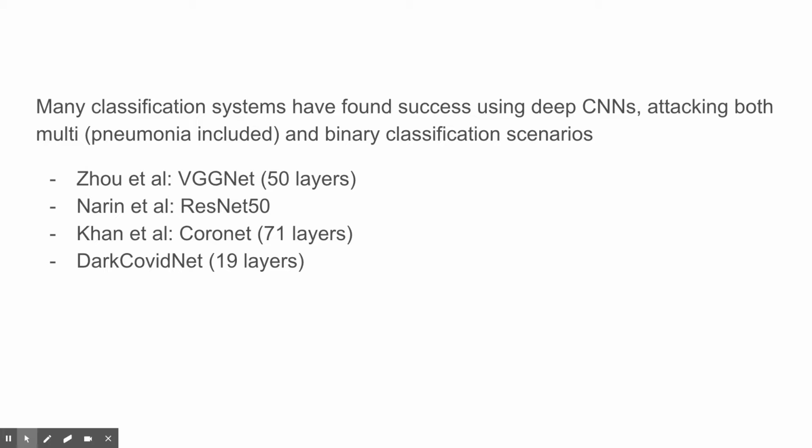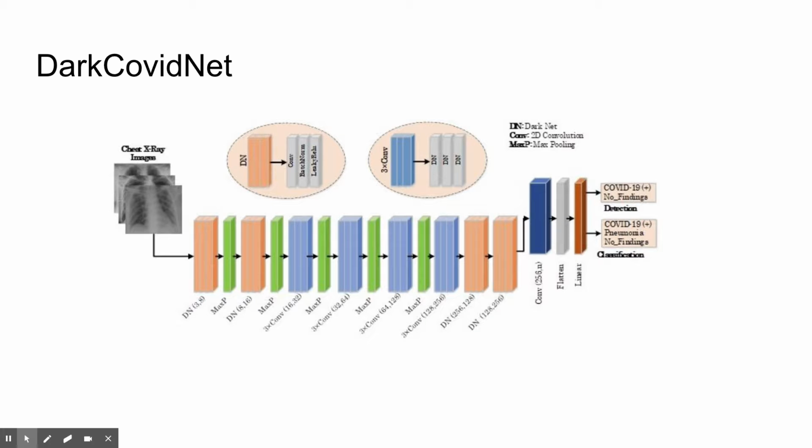These models tend to follow the general template of image classification models. Many of them were types of CNNs with a large number of layers. One model of interest is the DarkCOVIDNet model, which has a substantially smaller number of layers compared to the others we found. DarkCOVIDNet is made up of 17 convolutional layers and 5 max pool layers. The authors created these DarkNet layers where each convolutional layer is followed by a batch norm layer to standardize the inputs and stabilize the model overall.